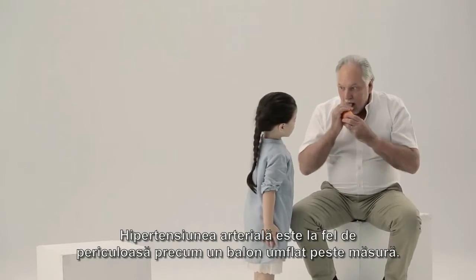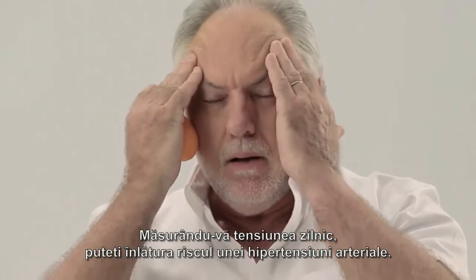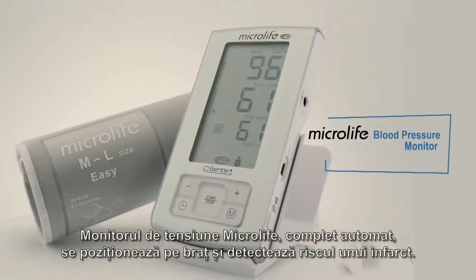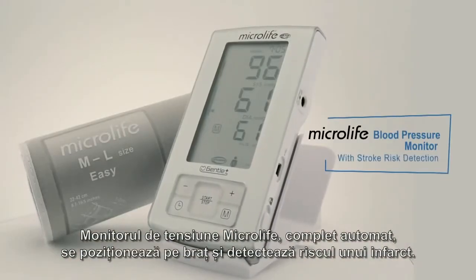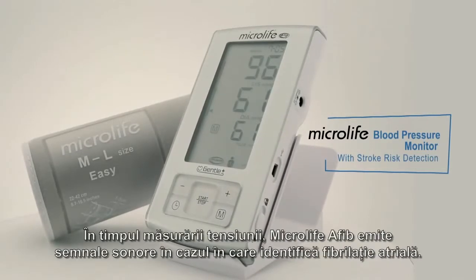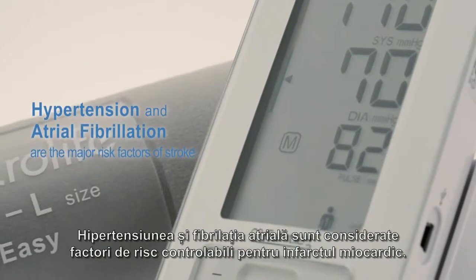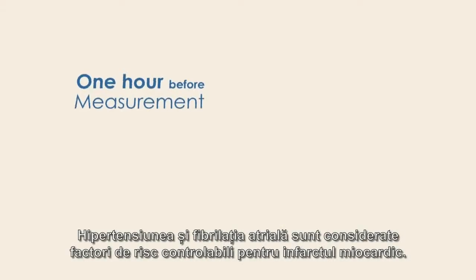High blood pressure is as dangerous as an over-pumped balloon. Measuring your blood pressure every day can save you from risk of high blood pressure. Microlife fully automatic upper arm blood pressure monitor with stroke risk detection. Microlife AFib screens for atrial fibrillation while taking your blood pressure. High blood pressure and atrial fibrillation are both considered controllable risk factors for stroke.